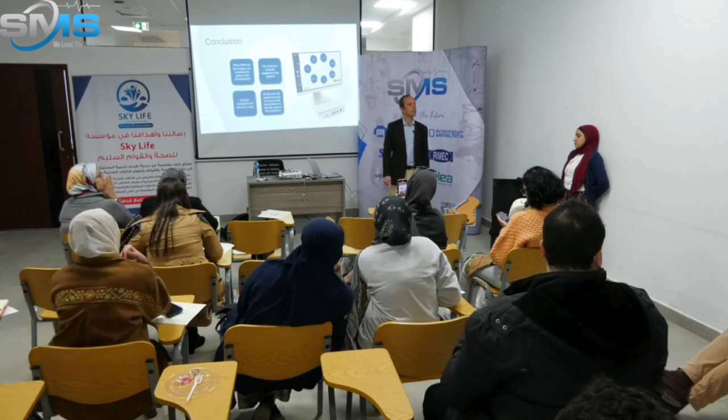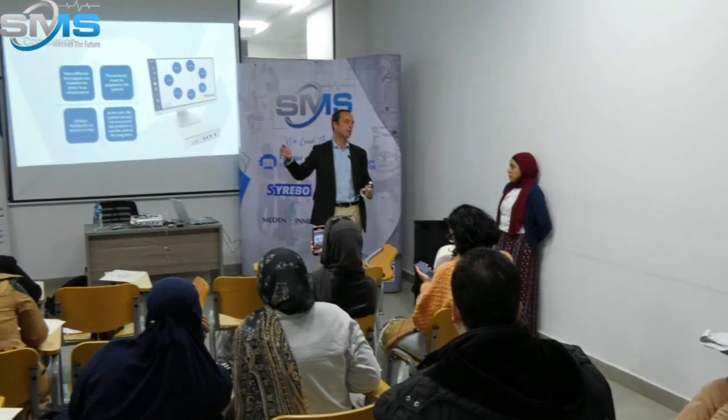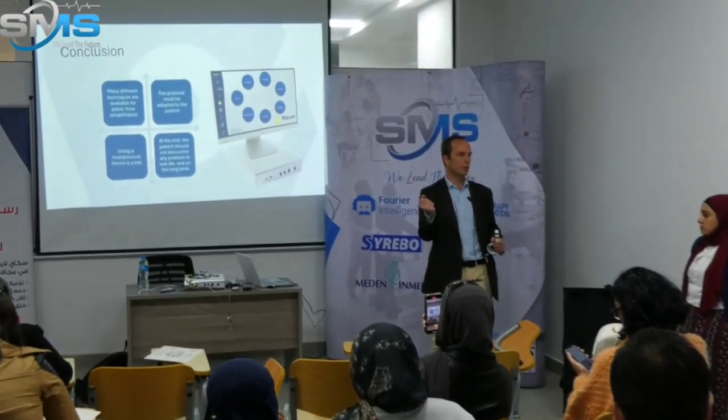Do you pick the abdominal contraction during the protocol? It's by surface electrodes, yes, exactly. But this is a pressure electrode, used inside the vagina. No, usually you use this kind. Just for the show I use a pressure electrode because it's easier to show.